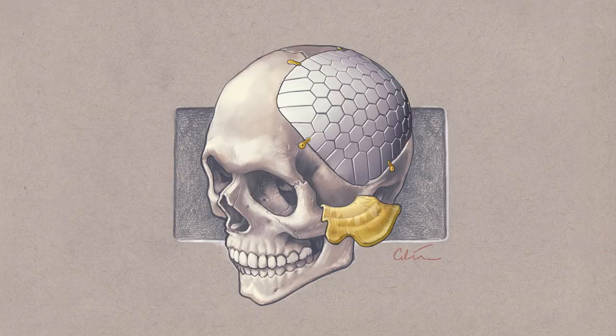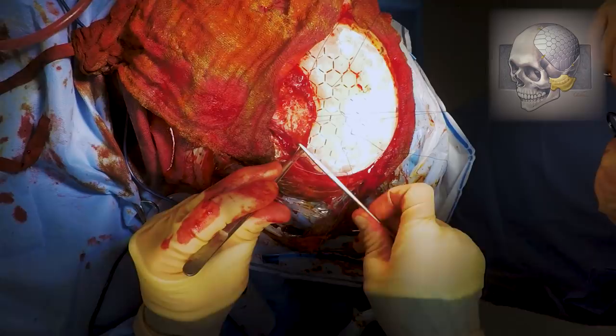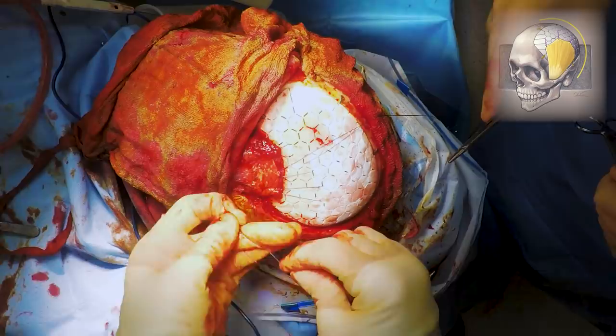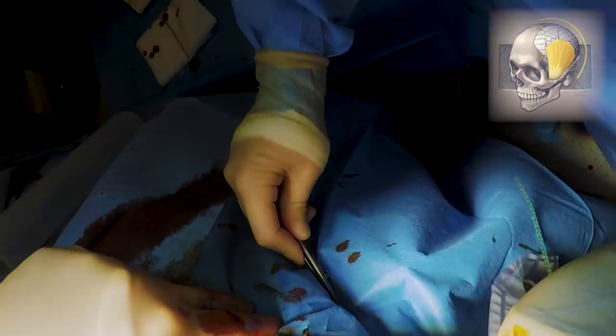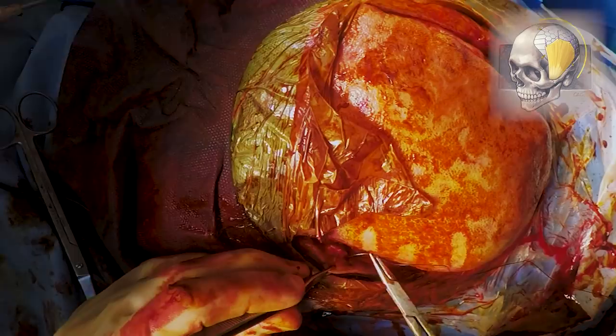Now we need to make sure that the temporalis muscle is stitched over the top of the plate. As I mentioned before this will help to give a good cosmetic result and the muscle won't slip back down towards the cheek and create a lump. Now the temporalis has been fixed to the skull plate helping to reconstruct the shape of the head. You can see Mr Uff performing hand ties and fixing everything down nicely. At this point the plate has been put in place and now all that's left is to leave a drain in case there's a collection of blood that will cause a problem after the operation. The drain just sits over the top and is tunneled out towards the top of the head. Now we're just going to make sure that the skin is stitched back together and start to wrap up the operation.